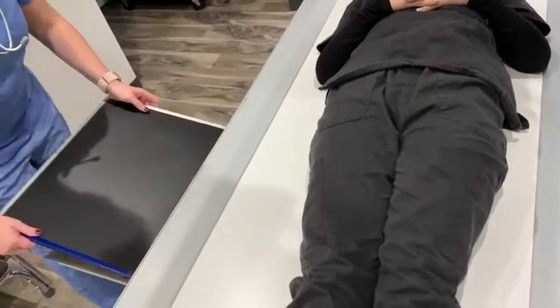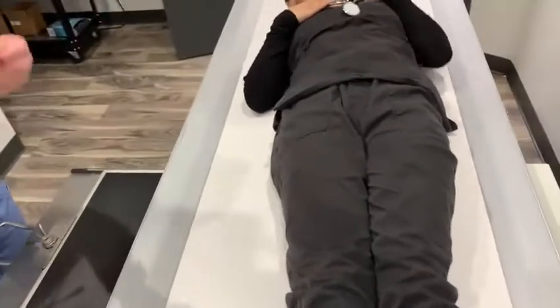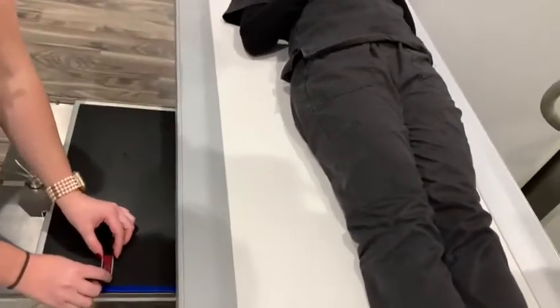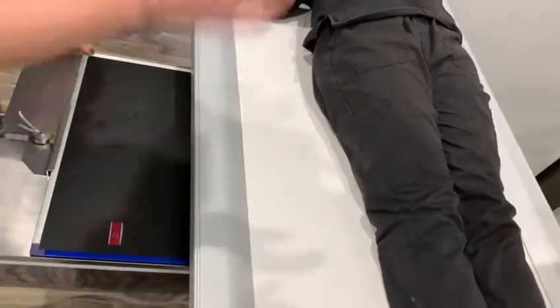So you're going to use the big board. Put it in. I usually put my marker on the board, and I put it in a little bit because you don't need the whole abdomen. You're going to comb down to just the spine, so marker there.